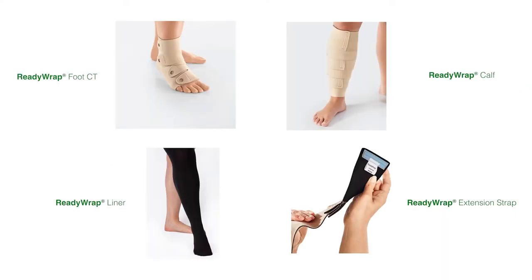The Foot Garment CT is available in left and right versions and should only be worn on the corresponding side. The calf garment has a muscle support spine and 50% overlapping straps. Extender straps are available, which add an additional 10cm to a standard ReadyWrap strap. A ReadyWrap Liner is also available.